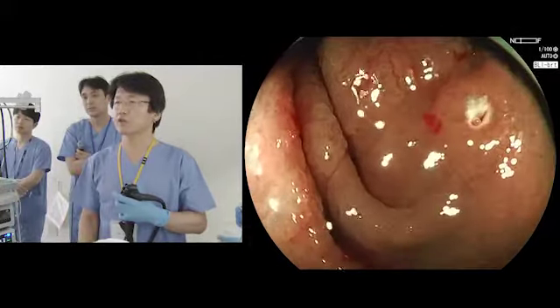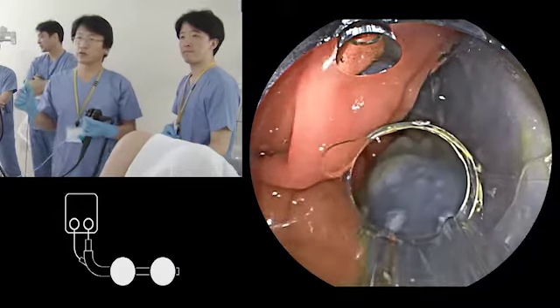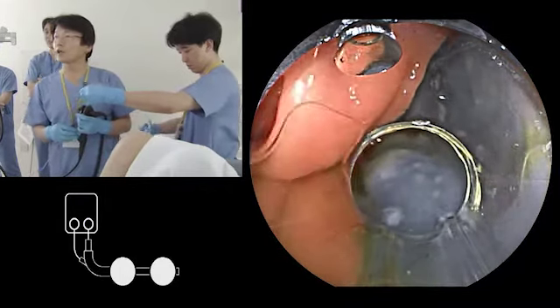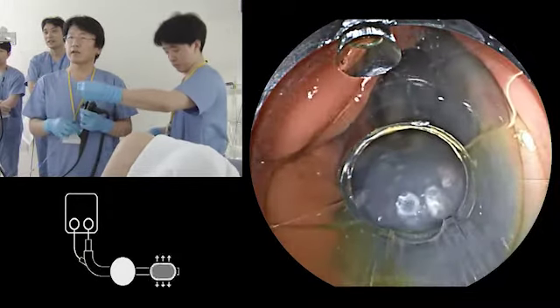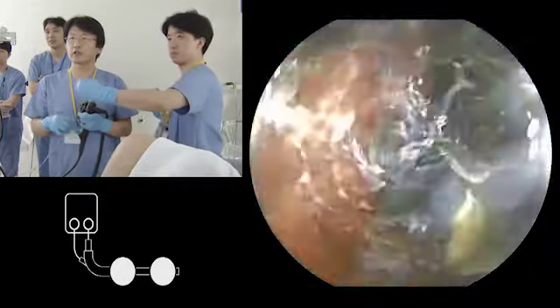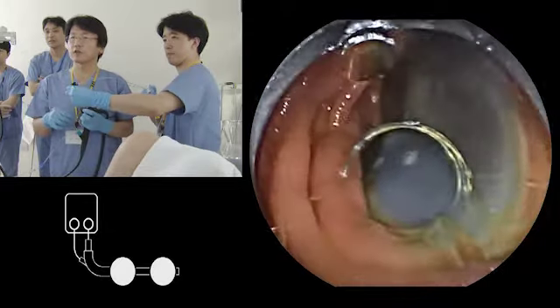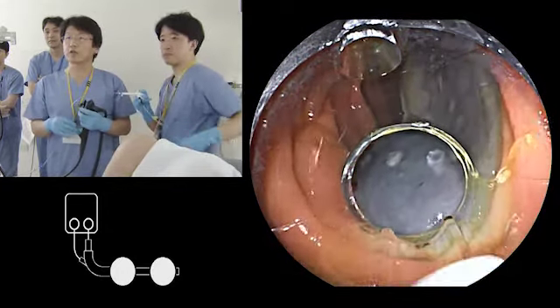That's what I want to show. I changed the scope to a short double balloon endoscope, that is EI-580BT. And that has 155 centimeters in the length. So you can use ordinary devices for a colonoscope, and you can get a stable condition.